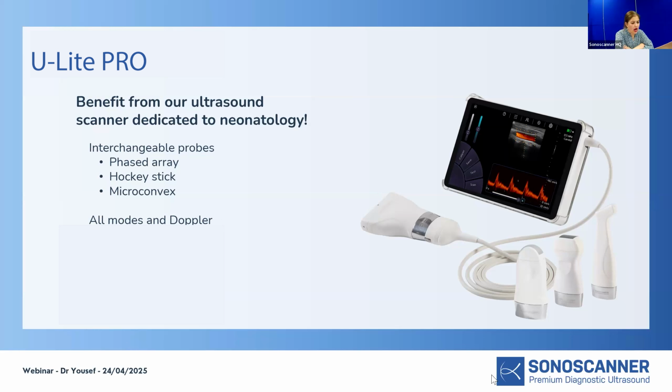You need to open up the lung. However, if the lung is relatively well aerated on low settings, this looks more interesting. Many teams are looking at this, also combining the diaphragm to see whether this could be interesting. I think it's a very important research question, and more than anything else, it's a very important practical question.